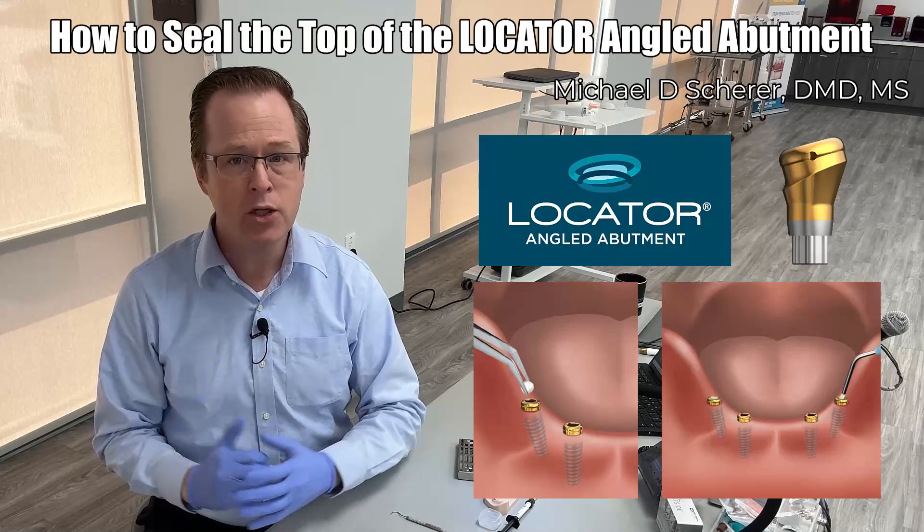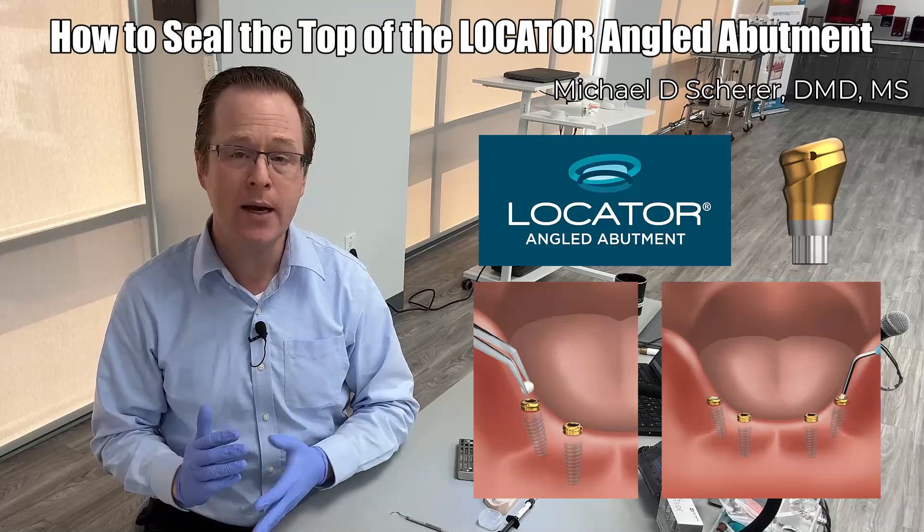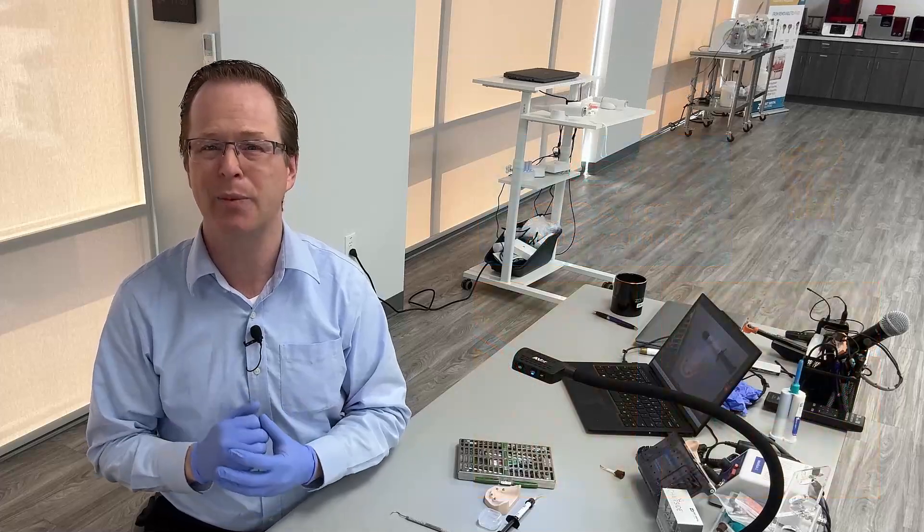Hi everybody, this is Dr. Michael Shearer. In this training video, we're going to talk about how we go ahead and seal the top of our locator angled abutment.